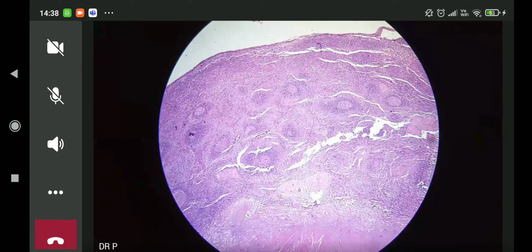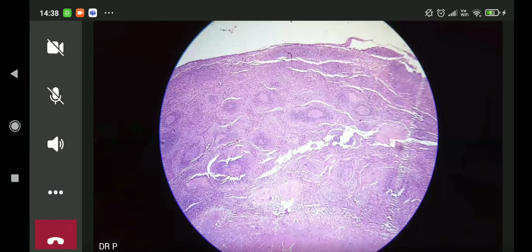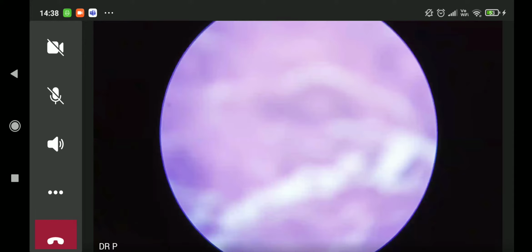Okay, so we go into higher power over here. Ma'am, can you use the cursor? Okay, I'll try.